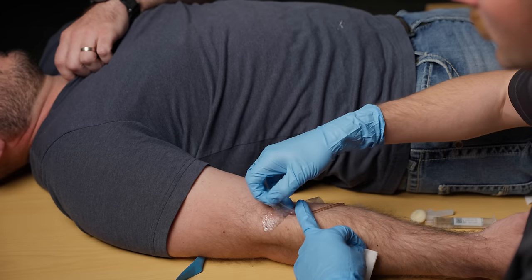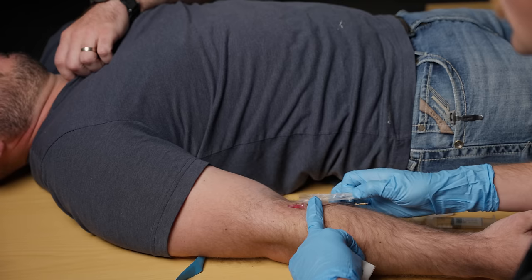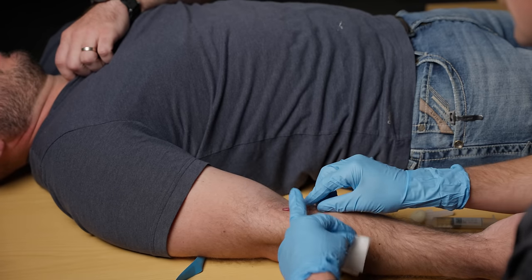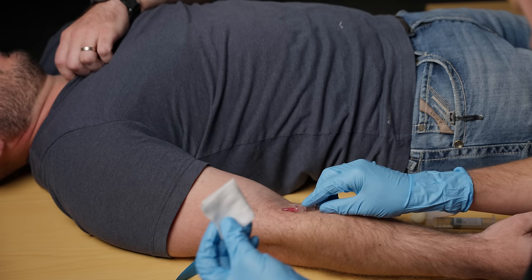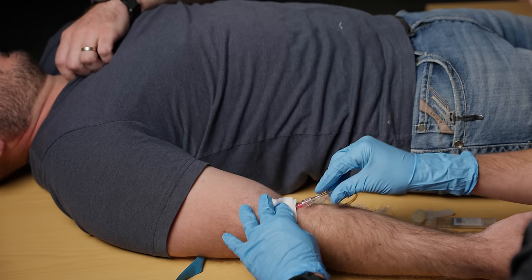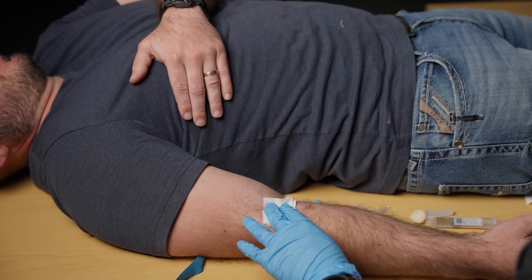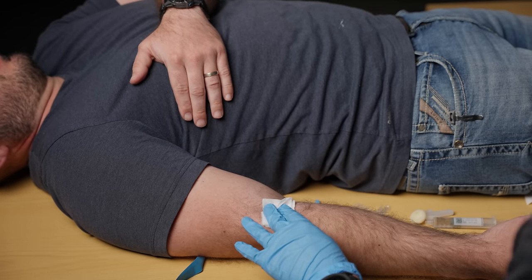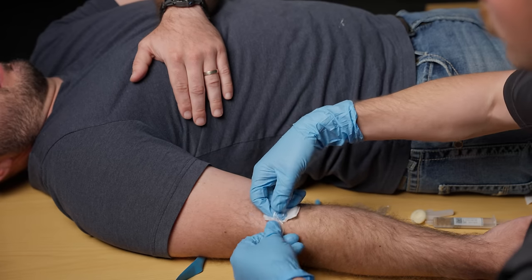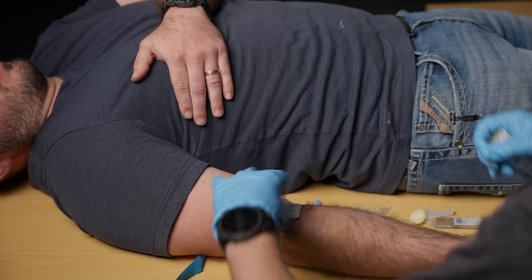Right here I'm going to start peeling back that Tegaderm, holding the IV in place, and obviously I don't want to touch around the site too much because that can cause increased risk of infection. Next I'm just going to take my gauze right over that hub and slowly remove it. The catheter can go away — it doesn't necessarily need a sharps container because there's no needle, but there is some blood in it so be careful. We can just take whatever tape we have left, tape it over the site, and you are good to go.